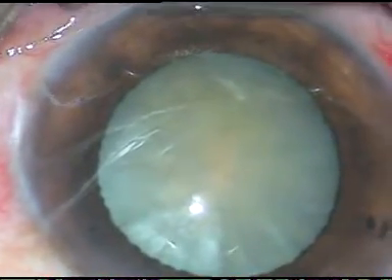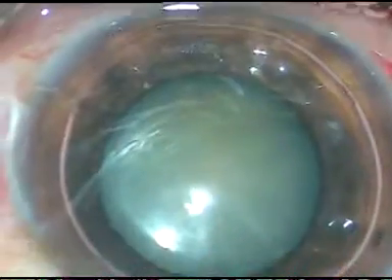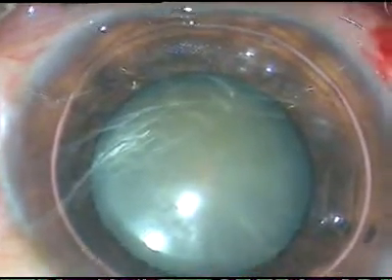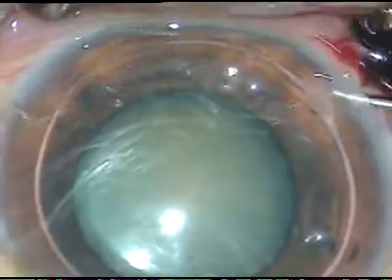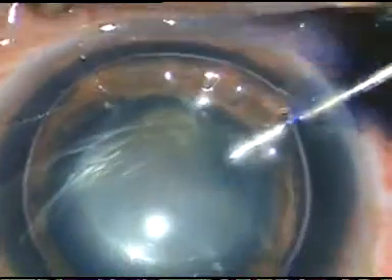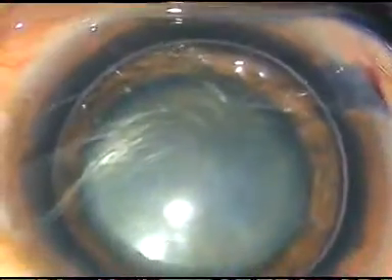I want to stain the capsule with trypan blue dye. I inject an air bubble, and beneath the air bubble, I inject trypan blue dye. This is 0.06% trypan blue. And now the dye is washed out.